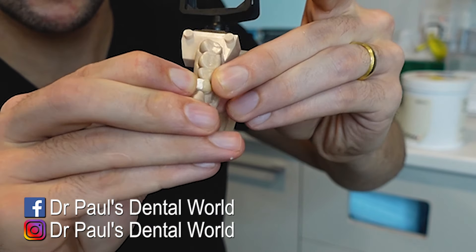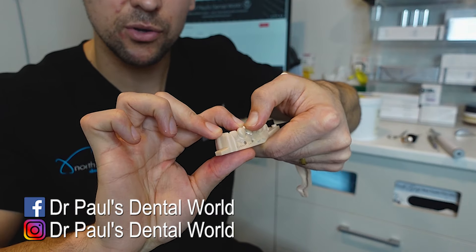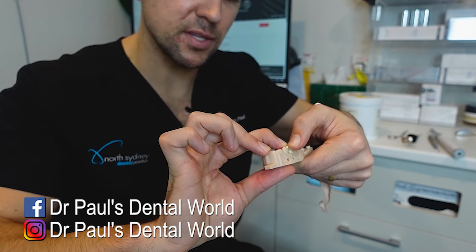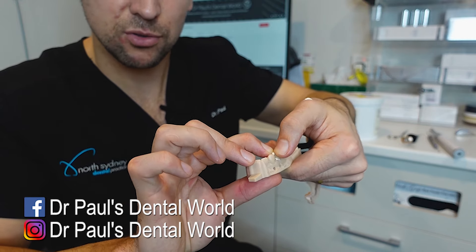And you'll see some of it's come out that end bit, some of it's around the margins. And then I hold it in place — about 30 seconds or so until it starts to set. Once it sets, I then start removing some with my probe. And then I come to the interproximals with some floss. Or if I can see that there's nothing there, then I don't worry — I just use my ultrasonic scaler.